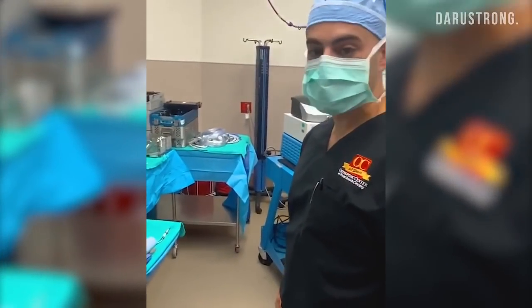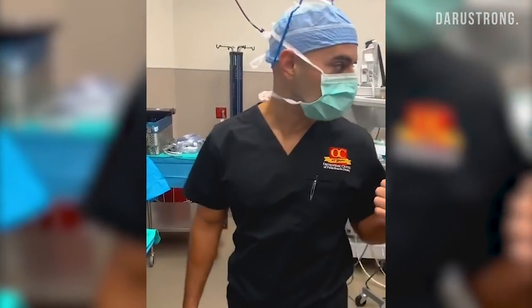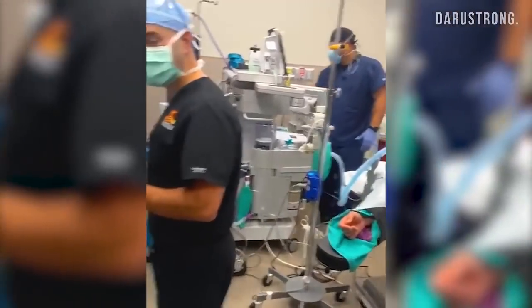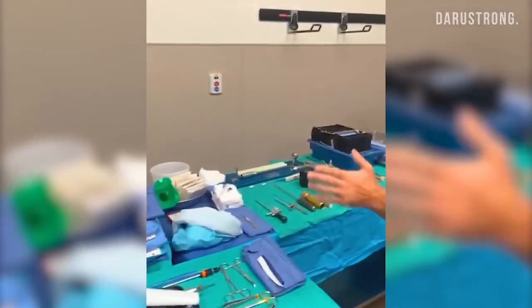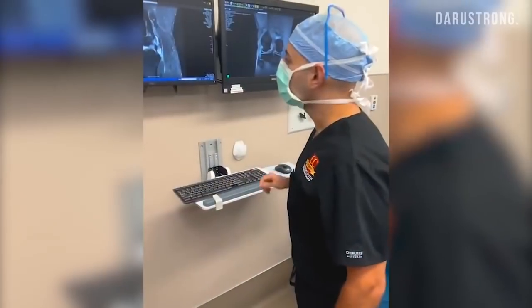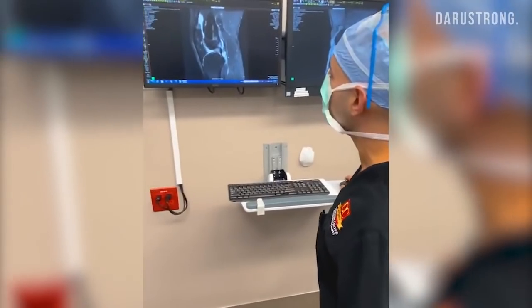Hey guys, Dr. Abbasi here. We're getting ready for Phil's ACL reconstruction. He's asleep. Let's take a quick look at the back table — all the instruments that are required for an ACL reconstruction. You can see all the plethora of stuff here, and we have Phil's MRI. I'd like to review that right before the case.